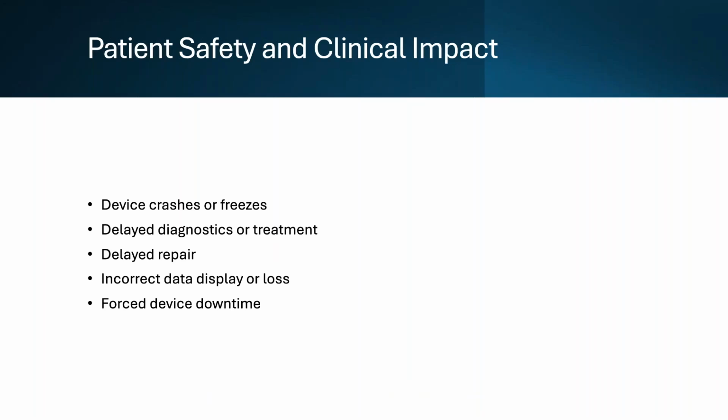Healthcare operates on tight schedules, and device unavailability creates cascading delays throughout the facility. For HTM, this means rapid troubleshooting, service coordination, and when necessary, recommending replacements or mitigation to reduce patient risk. Your role isn't just about keeping the devices running. It's about ensuring they're safe and reliable for patient care.